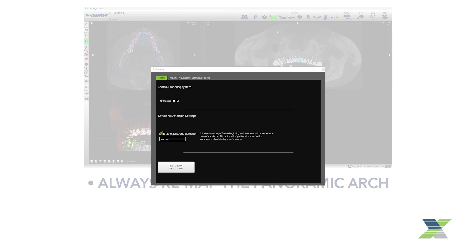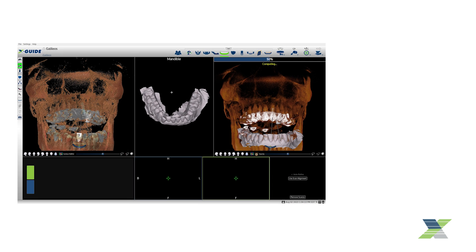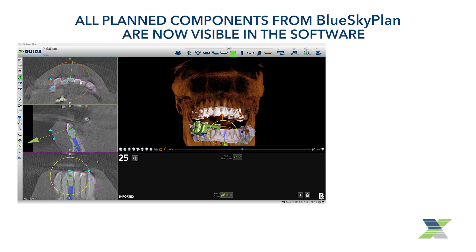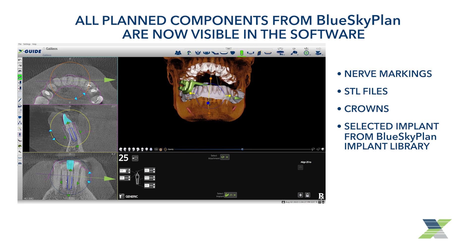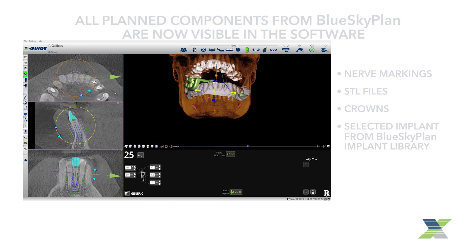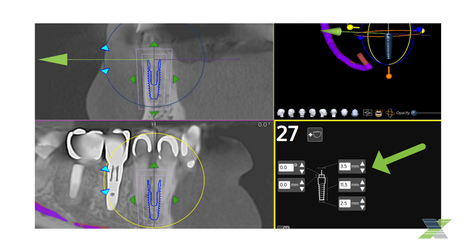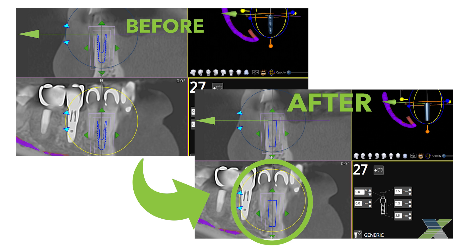Remember, the tooth number will reflect what you have selected in your XGUIDE preferences, either the universal or FDI tooth numbering system. Once mapping of the arch is completed, notice all the plan components from Blue Sky Plan are visible in the XGUIDE software, including nerve markings, any imported STL files, crowns, and the selected implant from the Blue Sky Plan implant library. You can edit any part of the plan if desired, although if you change the dimensions of implants imported from Blue Sky Bio, the implant converts to the XGUIDE generic implant shape.